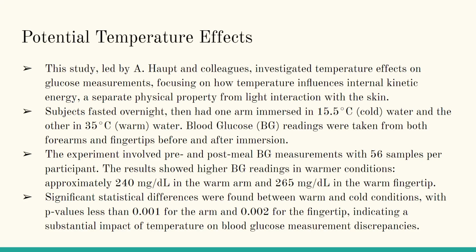So that causes some sort of latency in measuring the glucose, which means we might have to put limitations on which temperature is impossible for GlucoCheck or any glucometer for that matter to make accurate and reliable glucose measurements.